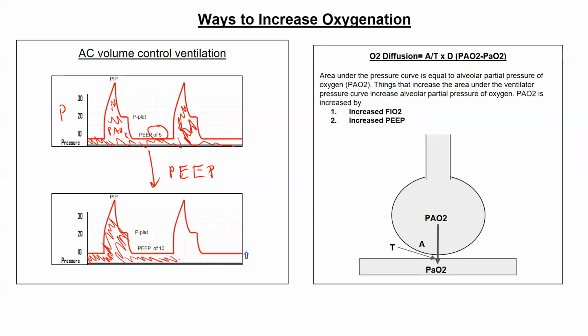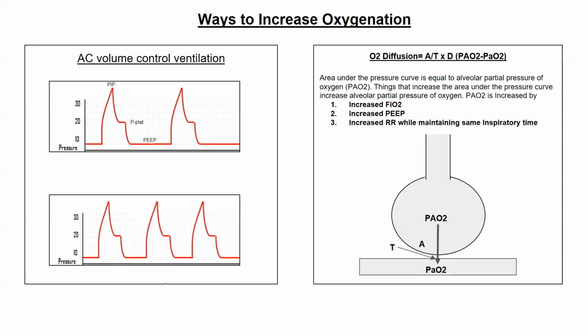That patient's partial pressure of oxygen is going to be increased throughout the entire respiratory cycle, during inspiration and during expiration, making that patient have an increased PaO2 over time. So that is the way that PEEP will increase your oxygenation. So that will increase it.